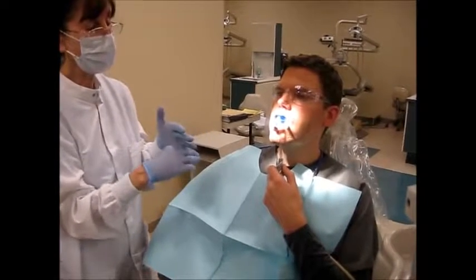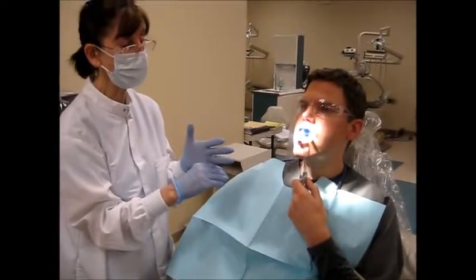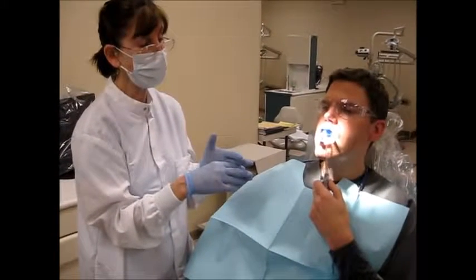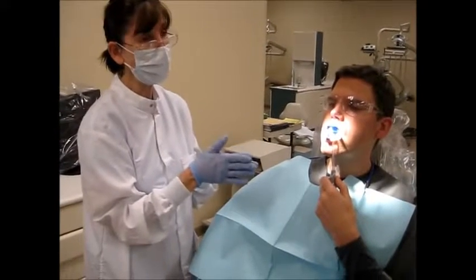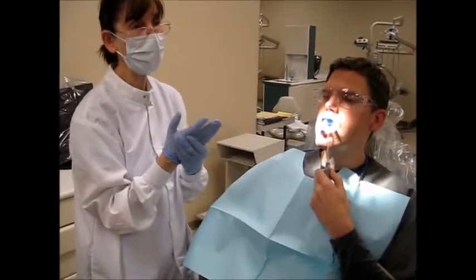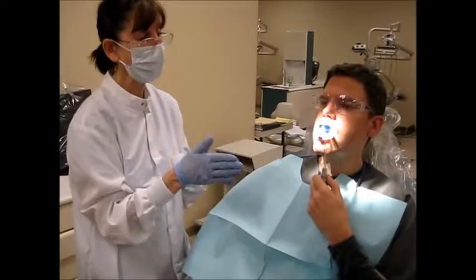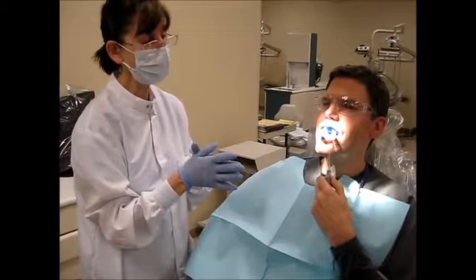At this point in time, I would go over any instructions with the patient regarding oral hygiene instruction that we had performed during the appointment, any reminder about any referrals that we had made for the patient, and then going over once again the benefits of the fluoride. I would also remind the patient that as I put that tray in, I had observed the clock and recognized that this was going to be in for 4 minutes, and I would be watching and monitoring that 4-minute period of time.